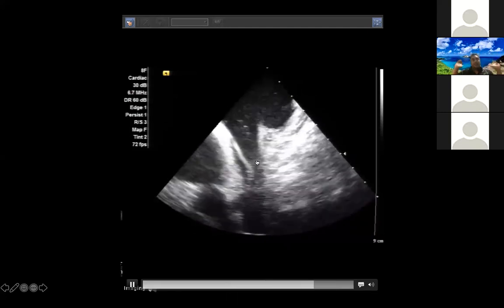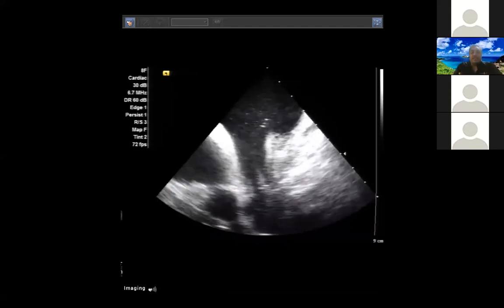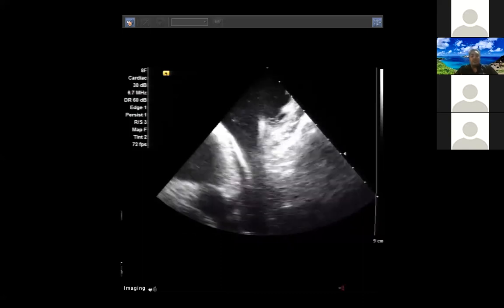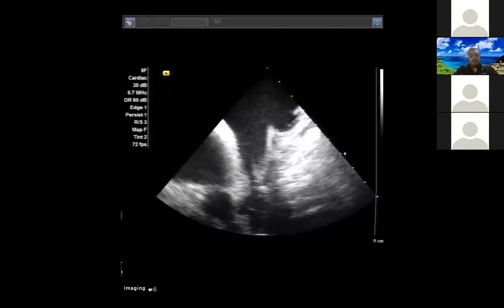That's the one thing. I think for many of us that are zero fluoro, we feel like we're defeated if we have to come on fluoro. I should just say, especially if you're starting out, there's no shame. Put the lead on, make sure you feel comfortable with what you're doing. There's no reason to push the limits if you're not comfortable.